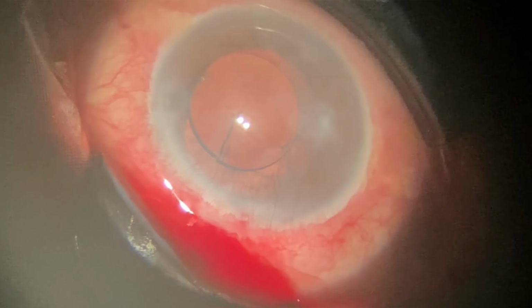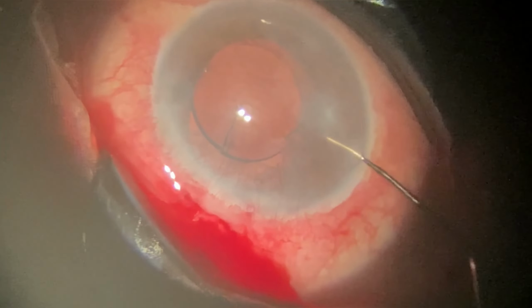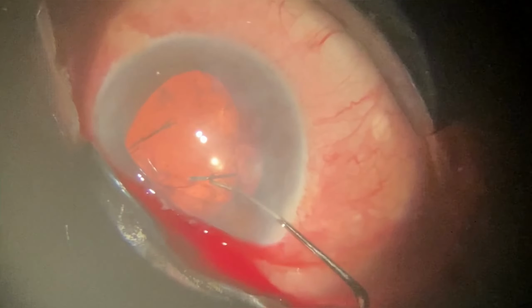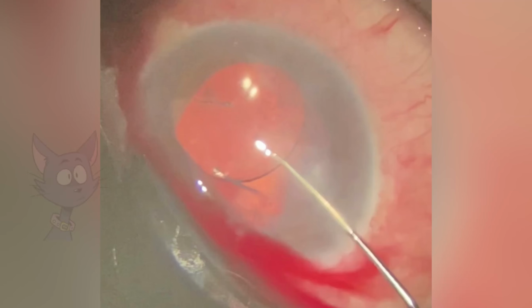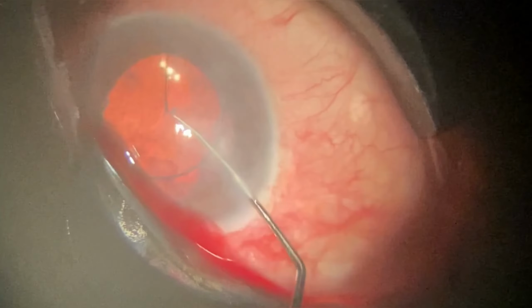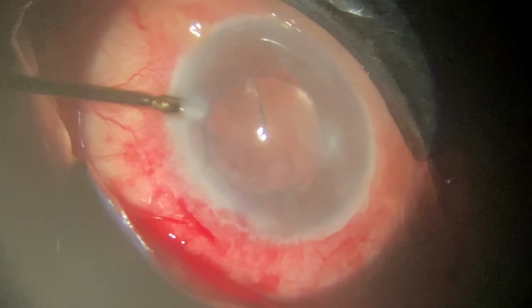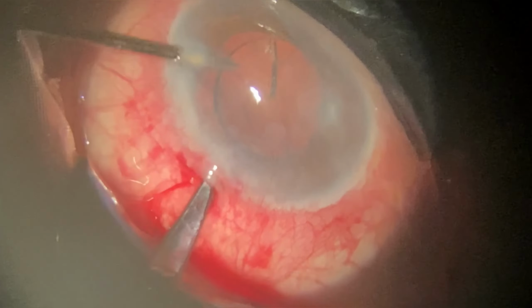After giving the first cut, I am rotating the intraocular lens so that the other part comes in front of the main port. Surprisingly, the other haptic was broken too, and this might be the reason for corneal edema and dislocation of the posterior chamber intraocular lens into the AC.